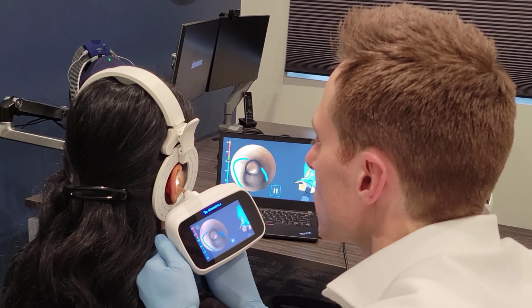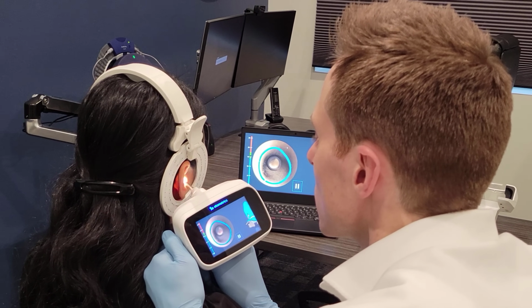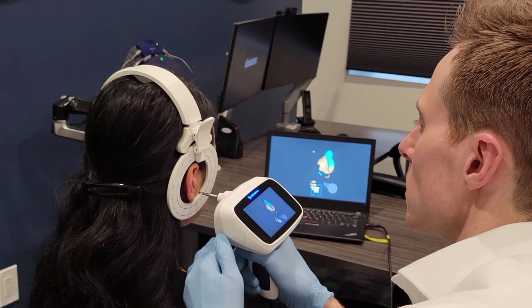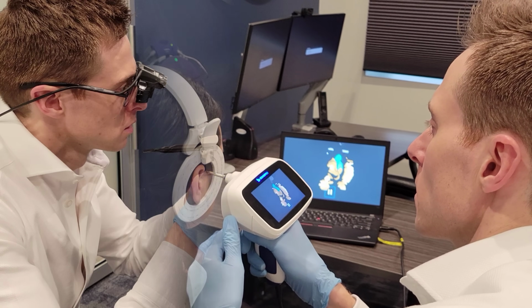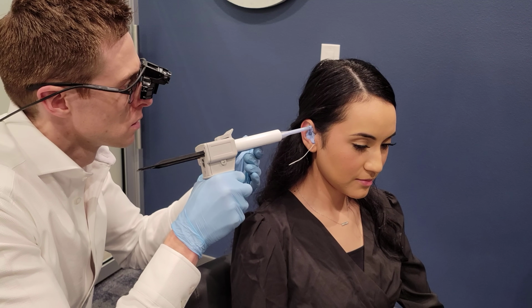Also, custom-built hearing aids are often easier to program precisely to your hearing loss prescription because they are perfectly molded to your ears with a vent size that meets the exact specifications for your hearing loss. Thanks to technological innovation, the impressions taken for custom in-the-ear hearing aids can now be done with digital laser scanners by your hearing care professional and 3D printed by a hearing aid manufacturer. So injecting silicone into your ear canals in many cases is no longer required.